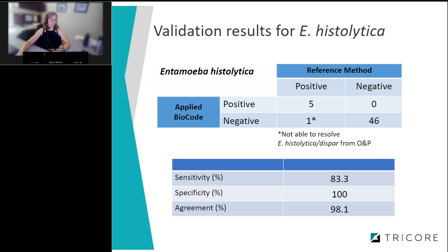But because we do not know, we have to put our sensitivity at 83.3%, specificity at 100%, and agreement at 98.1%.